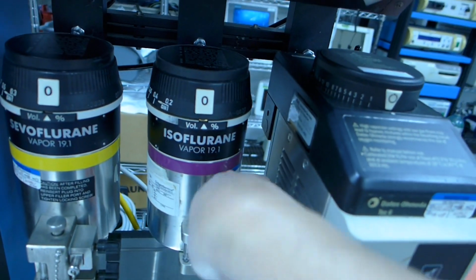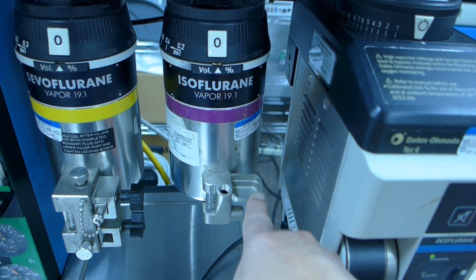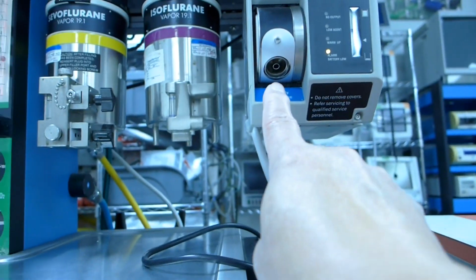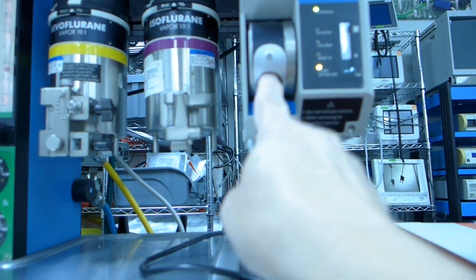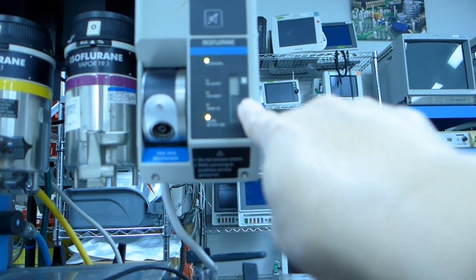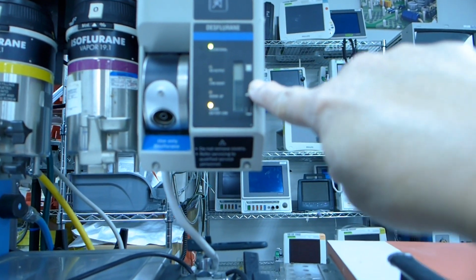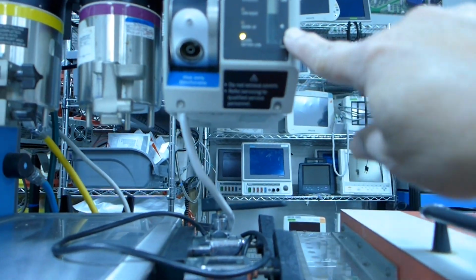Normally you can just pour the anesthesia agent in there. In this one there is a special connection, so you have to put the fill bottle in here and then just flip it up. It still has a little bit of vaporizer agent in here. See the label is here; the label tells us that there is some agent in there.